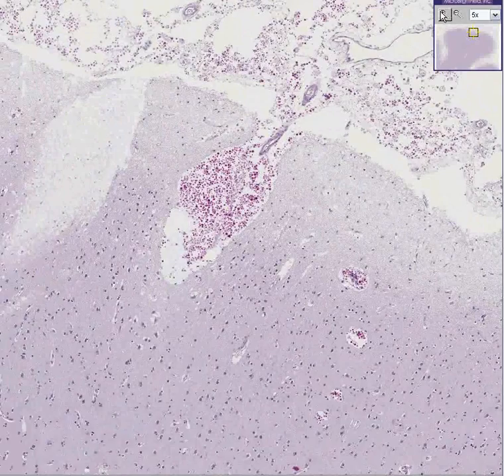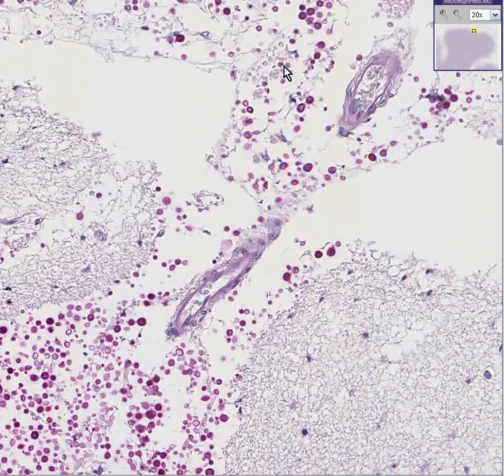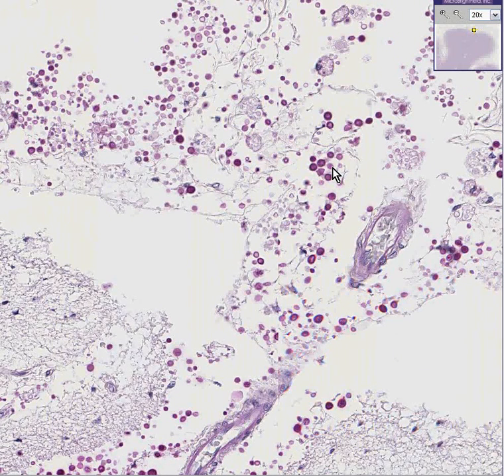In this case we're making the diagnosis from the autopsy. But when these patients come in and they're sick, they may be curable, because if you do a lumbar puncture — which would be very rich in these little organisms — and put them into a regular saline solution with India ink, these little yeast forms produce a big white zone within the India ink and have a characteristic appearance, even if they have a bud. So an India ink prep for a lumbar puncture is an absolute necessity in anybody that comes in with a meningitis or meningoencephalitis type of picture.